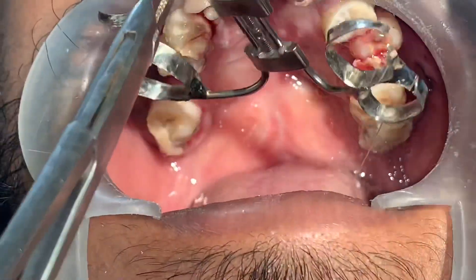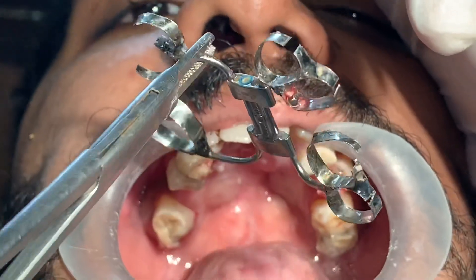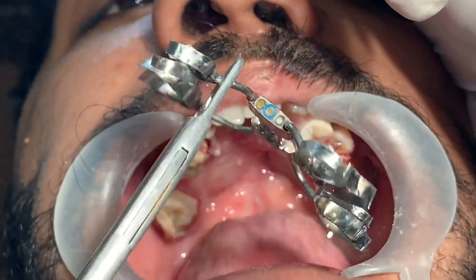You see how it comes out? Just show slowly. So this is how the distractor is — this is going to be thrown now, no use of it. You see the screw has been totally wound.